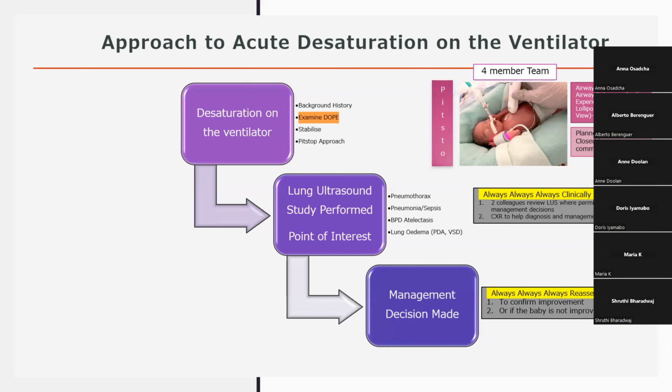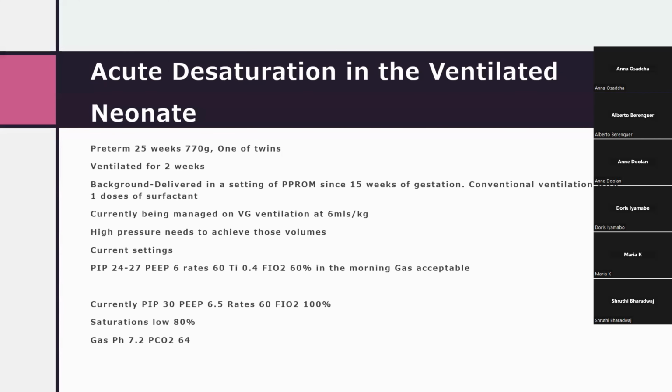If you're coming to the point where you're doing this in delivery suite after the baby's born, you're going to need UVC access from the bottom. And again, for a person who's right-handed, doing a left-handed procedure can be incredibly challenging. It needs a lot of human factors, a lot of teamwork, and a lot of good communication to ensure that you can do things appropriately. I'm just giving you a flavor here of how difficult it can be in these situations.